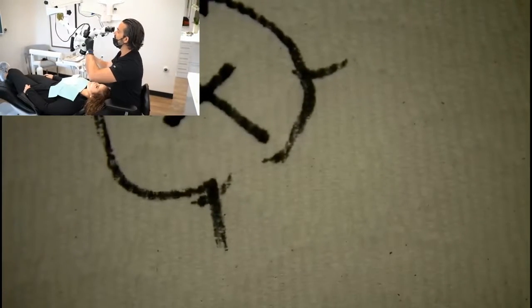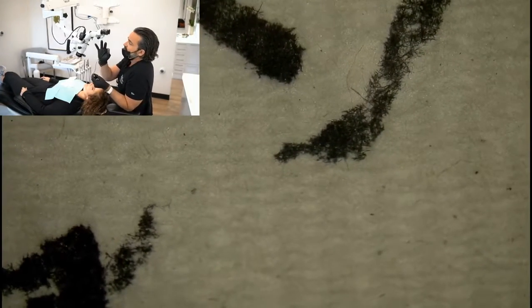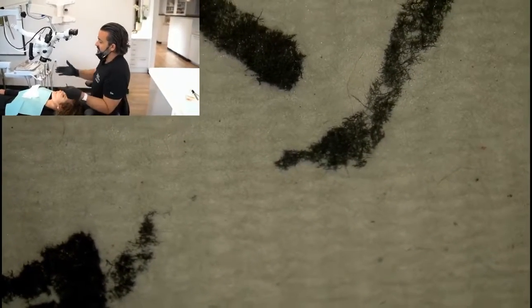All right. So I'm at my lowest magnification, and I'm in focus. Now, if I go up to my highest magnification and tweak this in a bit, then I can remain in focus. So part of it is you dial it in at the shallowest depth of field, and then that lets you proceed. Now, like I was saying earlier, that's fine, and it's true when everything is static.